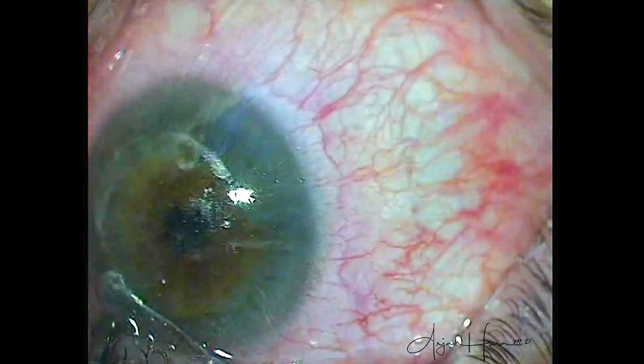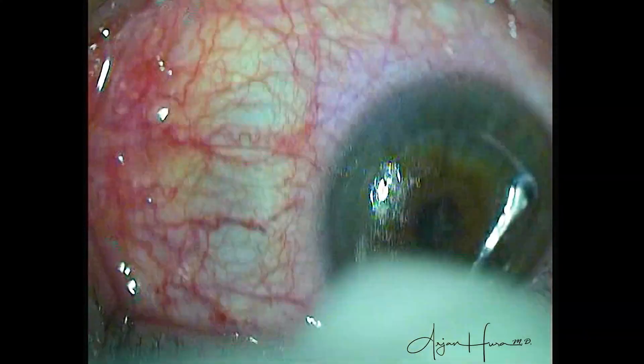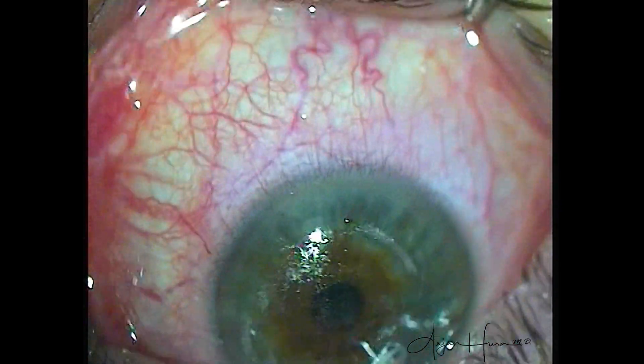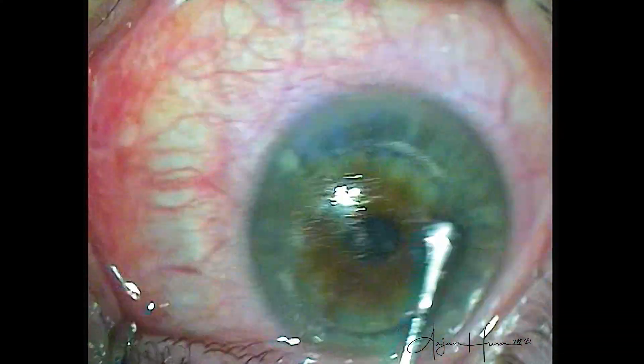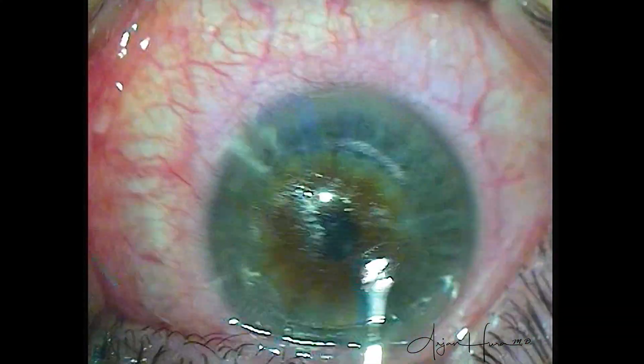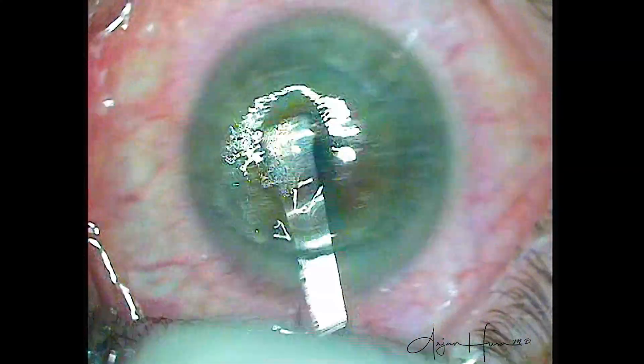But in the case of SMILE, you're dealing with a pocket — there is no flap you can lift to easily wash away the red blood cells. If you irrigate the pocket out at the slit lamp, you're working against gravity, and the SMILE incision at the superior cornea is often covered by the upper eyelid. It can certainly be done at the slit lamp, but ergonomically it's just easier to take care of underneath the Visamax laser.